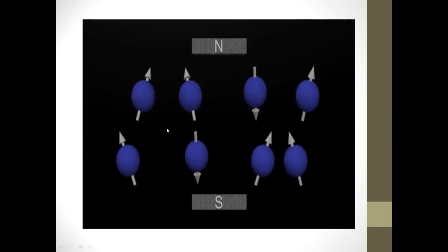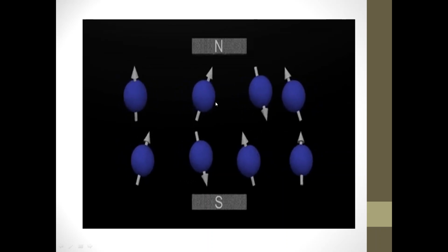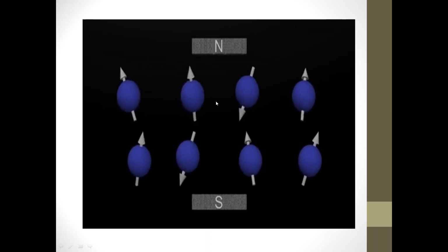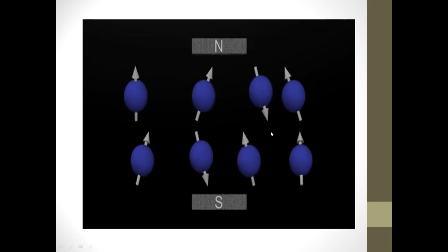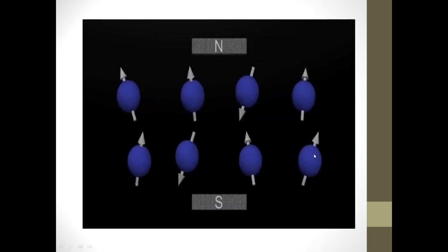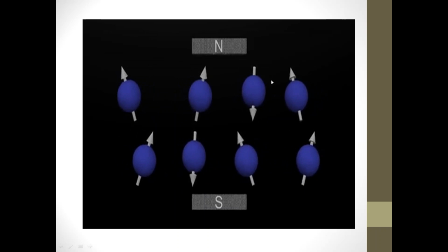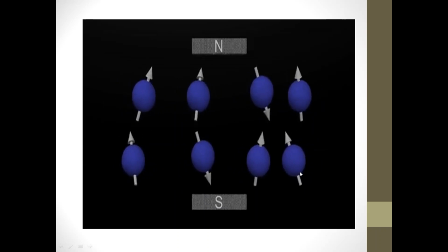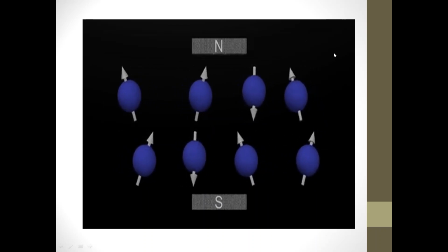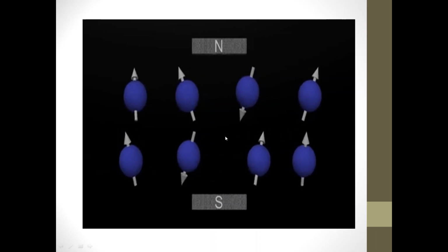If these protons are in phase, meaning all of them start and end together, then the net magnetization of the protons will be higher. Out of phase causes the net magnetization of the protons to be less. But these protons aligned with the main magnetic field add magnetization, increasing the magnetization of the magnetic field.